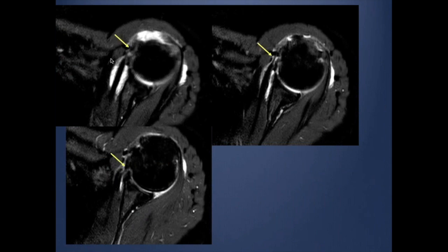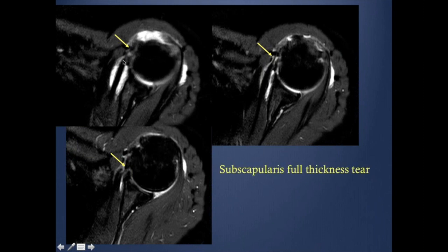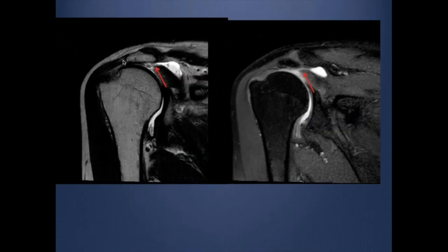Here is a case — after discussing the supraspinatus, infraspinatus, and teres minor, we move to the subscapularis tendon. In this case, you can see there is a full thickness, complete tear of the subscapularis tendon, as well as a full thickness tear of the supraspinatus in the same patient. This is when we call it a massive or major rotator cuff tear.